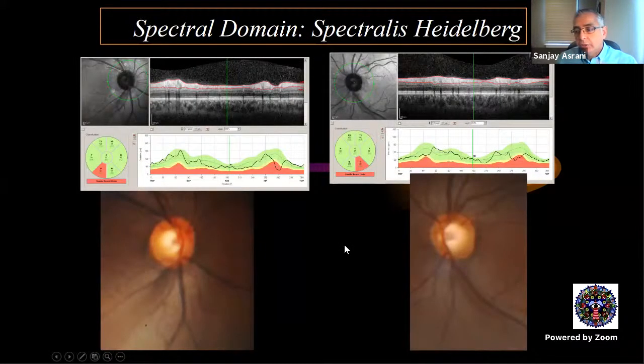I want to share with you one more thing, and that is what is the strategy of the Spectralis, because it is different than the strategy of the other machines. The strategy of the Spectralis in measuring nerve fiber layer is 768 points of measurements in this circle. And then those points are laid out for you as a ribbon, starting from the temporal, going all around like this and coming back here. So this is here, this is here, and so on and so forth.